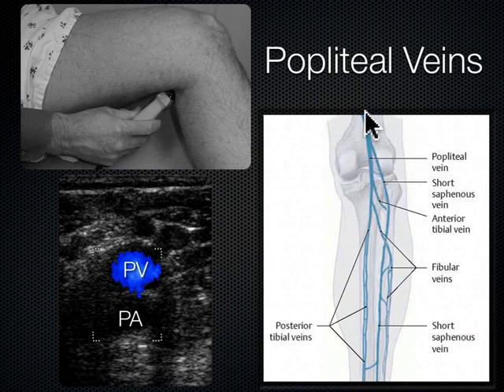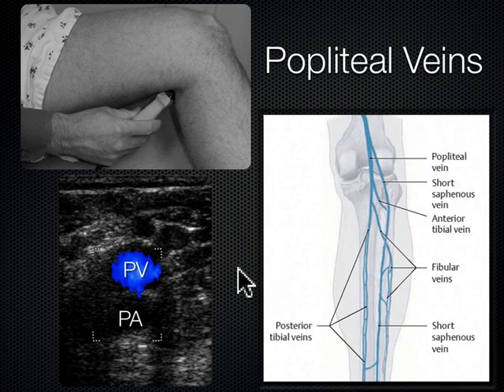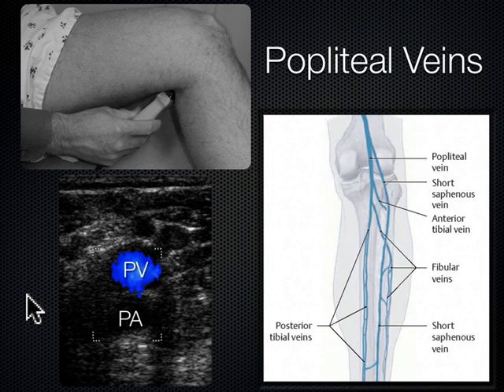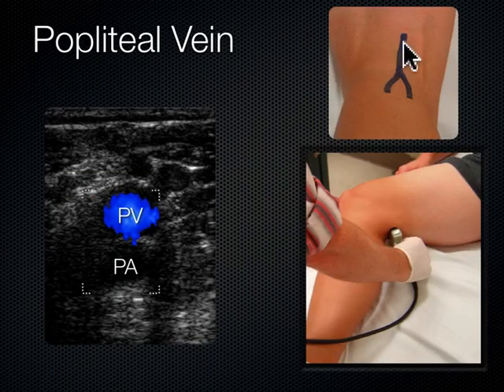In the popliteal fossa the popliteal vein comes down and bifurcates and trifurcates — it's such small caliber down in the calf that we don't really care about it clinically. Those small calf veins, even if they have a clot, we don't treat them anymore, though they do come back for repeat scans. We're really concerned with this popliteal region. Here's the popliteal vein up here, popliteal artery down — the vein comes to the top in the pop.